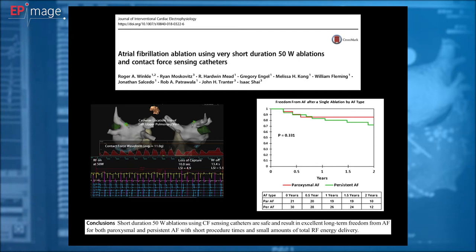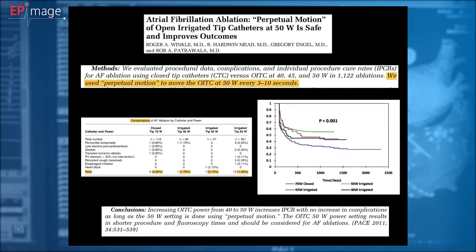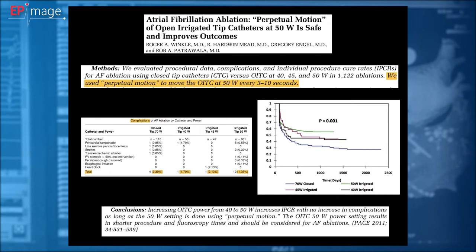They also showed in other paper that high power 45, 50 watts ablation is really safe. They performed more than 13,000 applications in over 10,000 patients with very low complication rates. And when you move back in time to 2011, you will see that the same author published his results with 50 watts ablation with not contact force catheter, and the results with 50 watts were quite impressive.